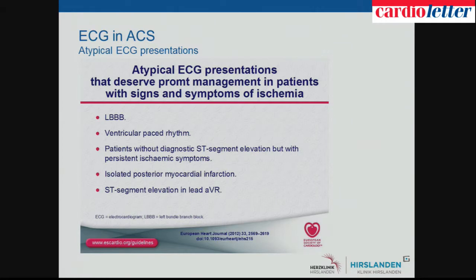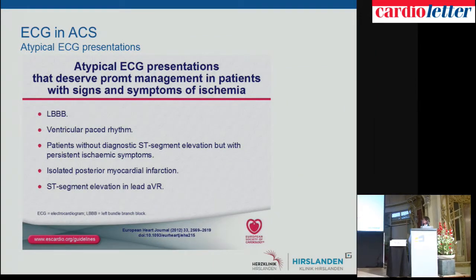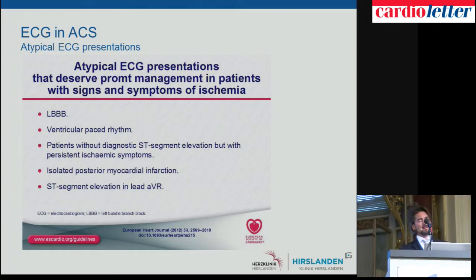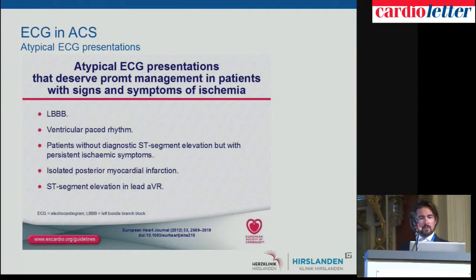So what about atypical ECG presentation? We realized in the last years that besides ST elevations, T negativations, and ST depression, we also have some conditions where the ECG diagnosis gets quite tricky. These are bundle branch blocks and ventricular paced rhythms. A very important category is patients with persistent ischemic symptoms but without diagnostic ST segment elevation. We have the posterior ischemia. We have the famous aVR lead. Let's have a look at them.